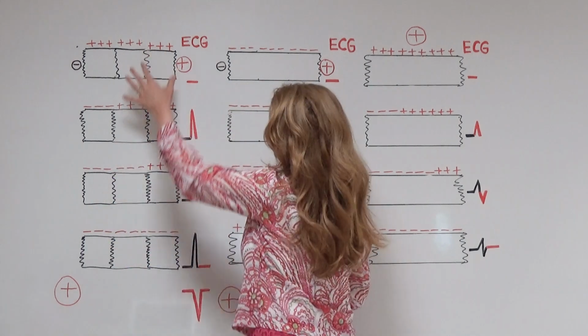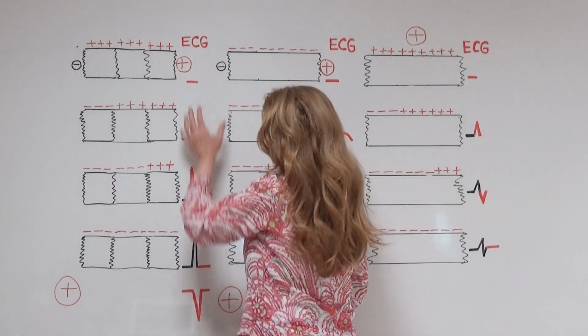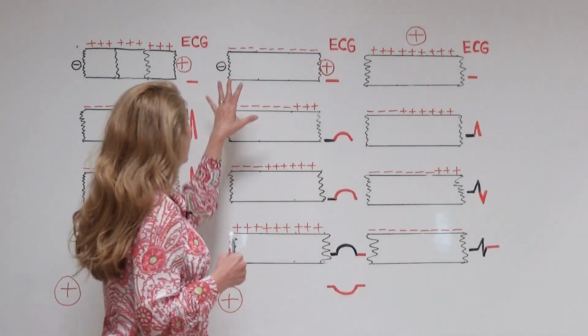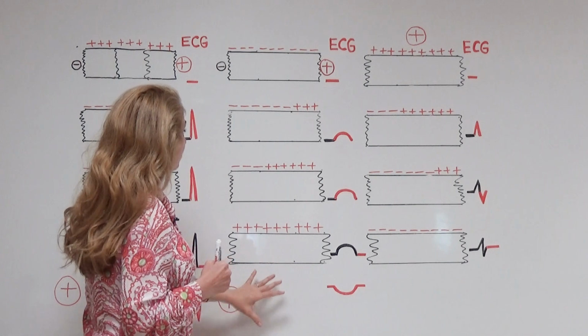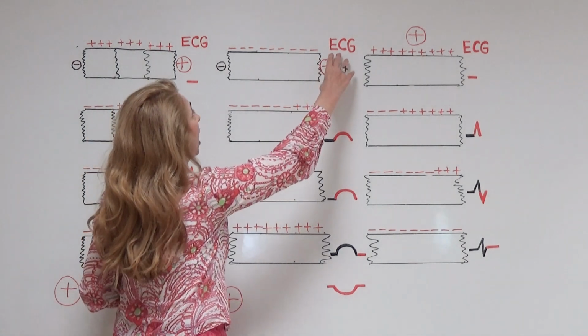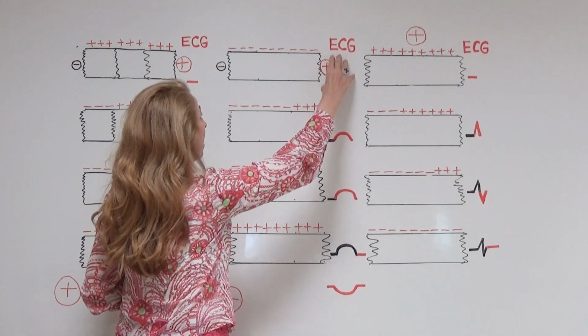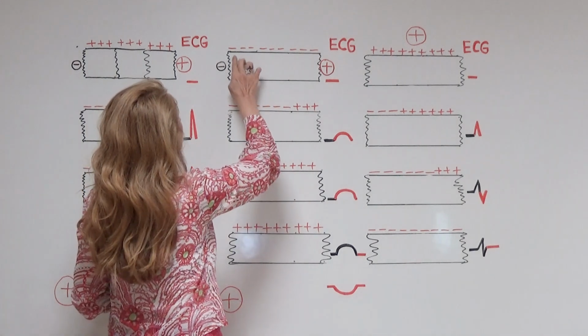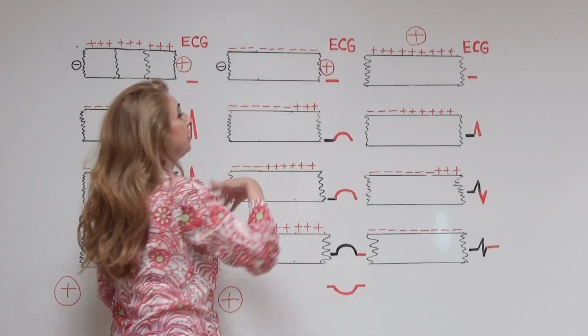We have talked about depolarization and how the electrocardiography waves form during depolarization. Let us move on to repolarization in the list here. The same group of cells are here. Our positive electrode is still on the right side of these cells. Before repolarization starts, all cells are depolarized.